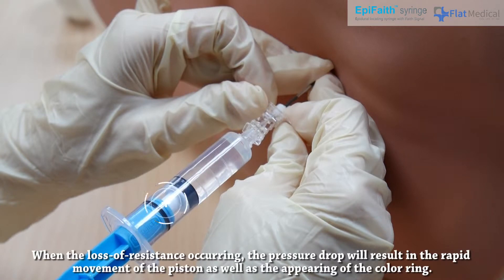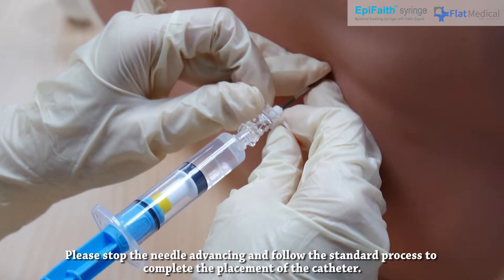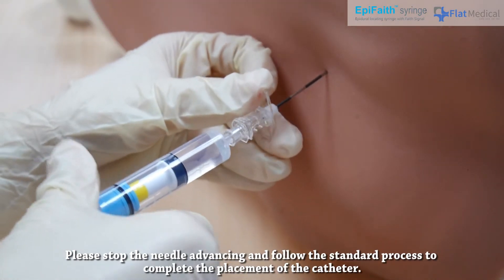When loss of resistance occurs, the pressure drop will result in rapid movement of the piston as well as the appearing of the color ring. Please stop advancing the needle and follow the standard process to complete the placement of the catheter.